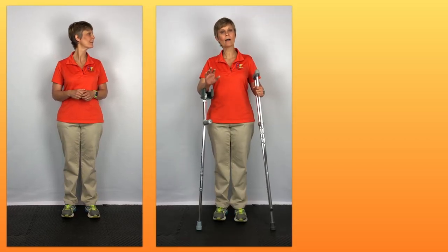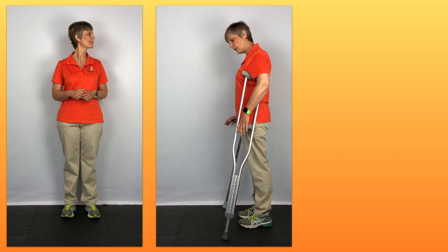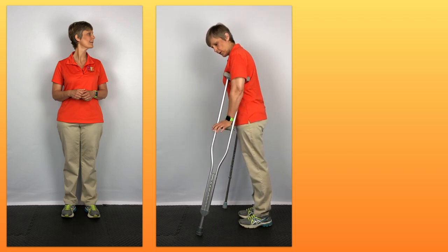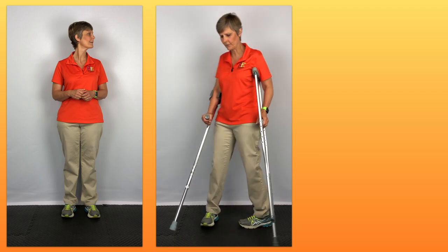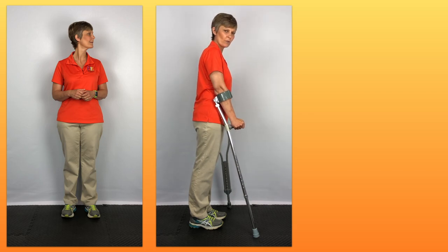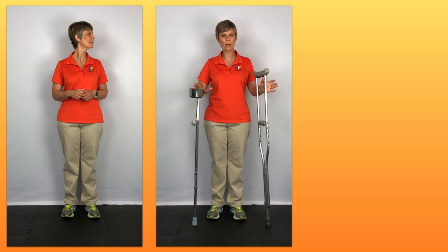Now let's talk about posture. I haven't seen any specific studies on posture, so if anybody has a link to one, please send it our way. After using both crutches, I feel it was easier to maintain my posture with the forearm crutch. When advancing the axillary crutch, I feel like my body has to lean a little further forward to get my weight bearing onto the hand grip. With the forearm crutch, because of where my arm is locked out, I'm able to maintain a more upright posture. Again, I haven't seen studies specific to that, but that's what I experienced using the two.